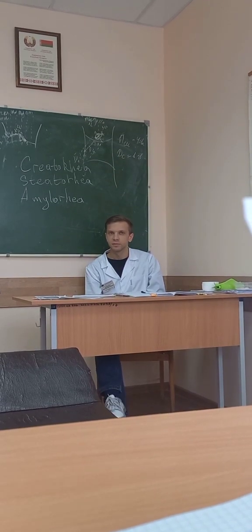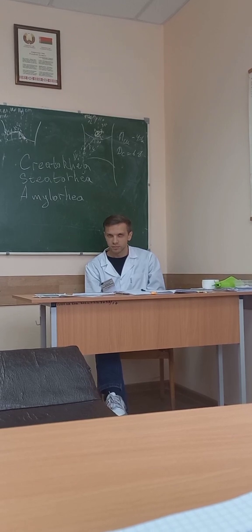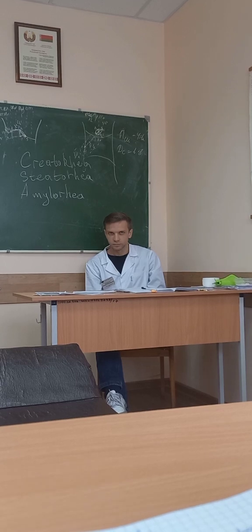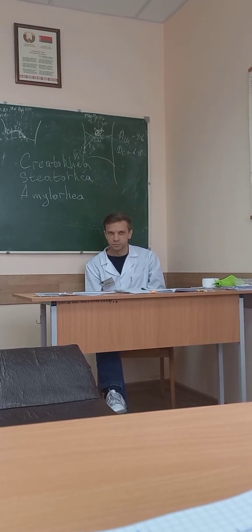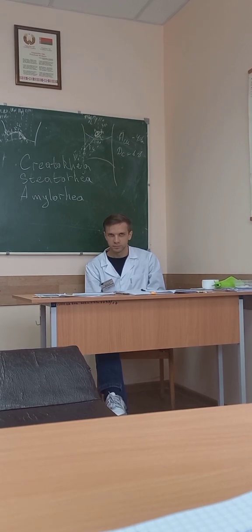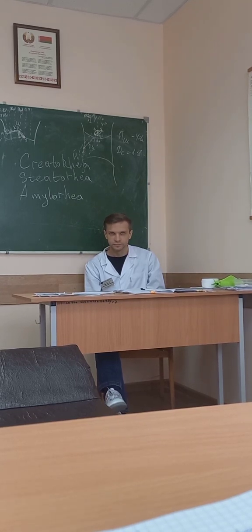And doctor, this one: consistency semi-liquid, color brown, reaction alkaline, smell putrid, hidden blood present, so putrid dyspepsia. Muscular fibers, undigested fibers 6 to 8 with striated patterns, so creatorrhea. Fatty acid present, so steatorrhea.